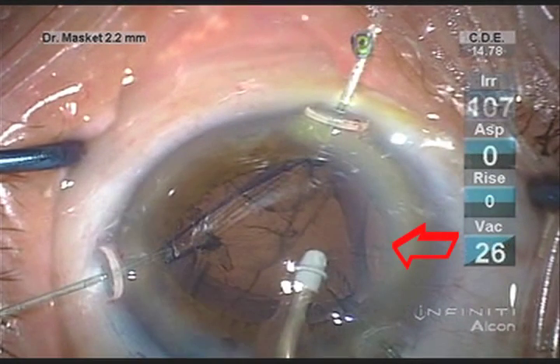However, at one point I noticed that the zonules inferiorly were loose for about one and a half clock hours. At this point, I called for a Henderson modified capsule tension ring, given that cortex was still present in the chamber. I also elected to switch from a coaxial to a bimanual IA system as it can be more friendly to the zonule structures.